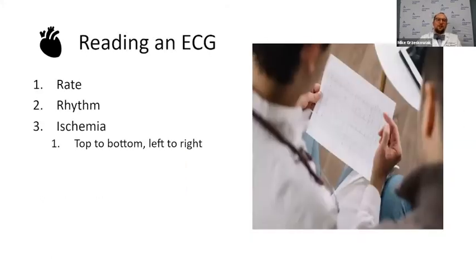So first I want to talk about a method for reading EKGs. As a cardiology fellow, whenever I look at an EKG, I actually have a 10-step process that I go through in my head every single time I look at an EKG, whether it's a new patient in the emergency room, whether it's a STEMI patient in the ED, or it's a new consult. The reason I do that is so that I don't miss little things, right? If you just glance at an EKG trying to see what sticks out to you, you're going to miss stuff.